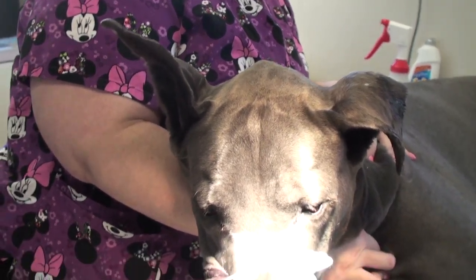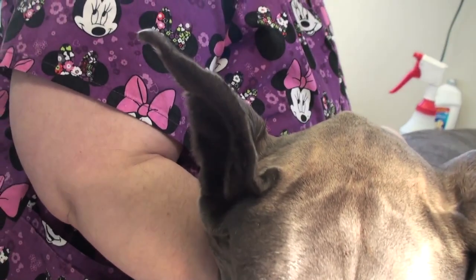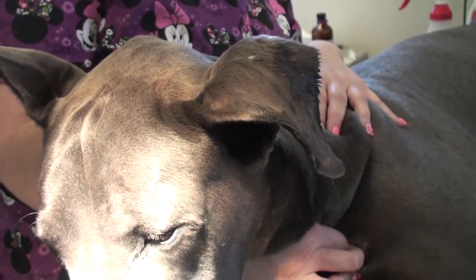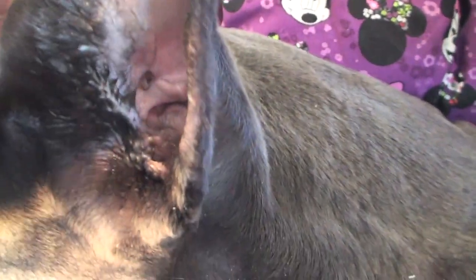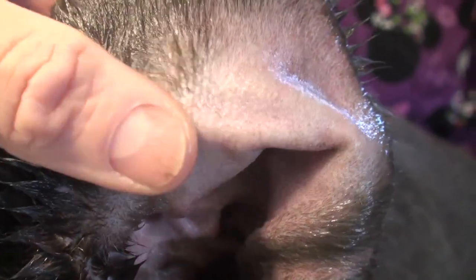Today we have this two-year-old Great Dane that had an ear crop. Sometimes this happens — the other ear never stood up. The left ear never stood up. My nurse prepped already, but we want to re-prep it again. Unfortunately, sometimes they have folds here that inhibit the ear from getting straight.